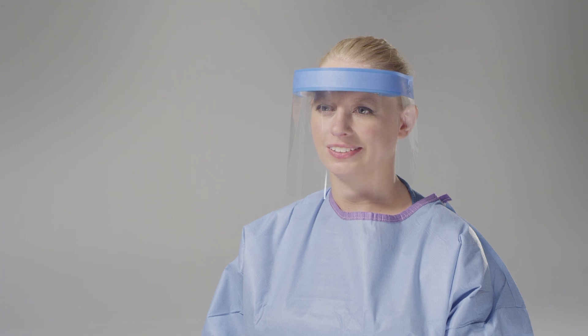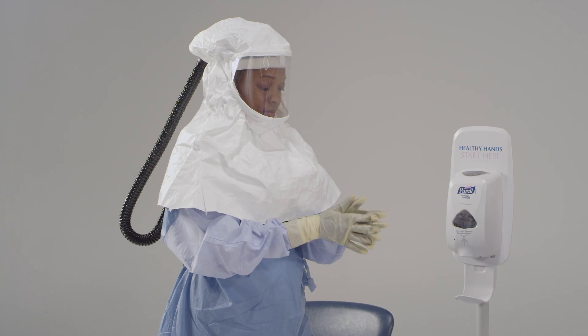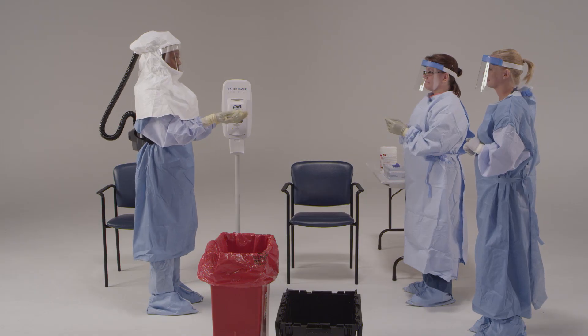Now it's time to disinfect your outer gloves again. You will need to disinfect your outer gloves with an EPA-registered disinfectant wipe or an alcohol-based hand rub.